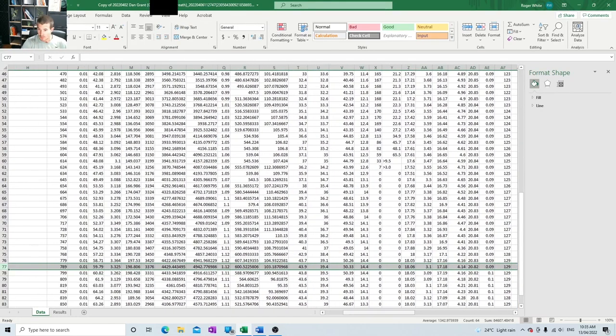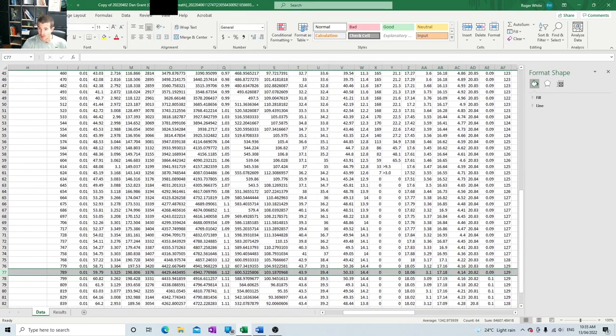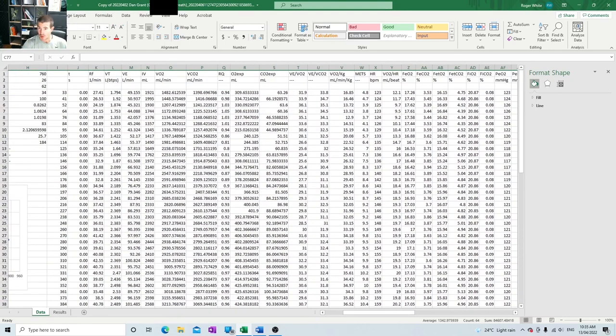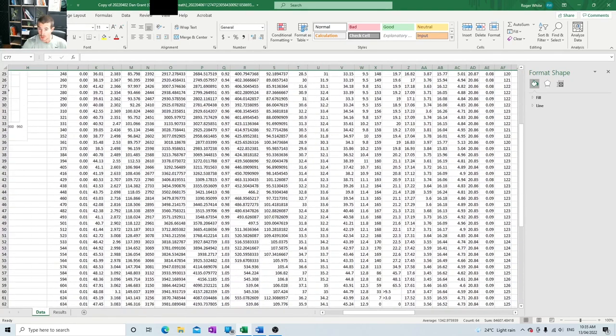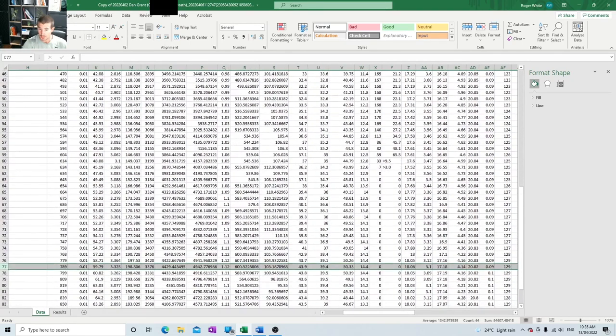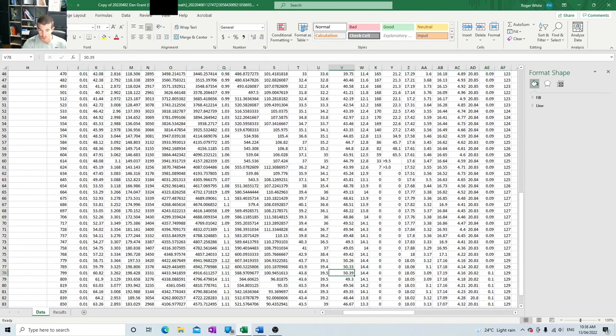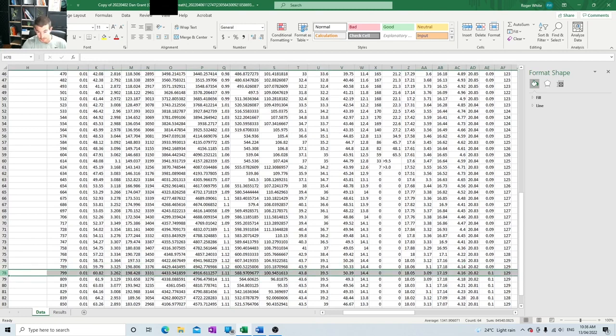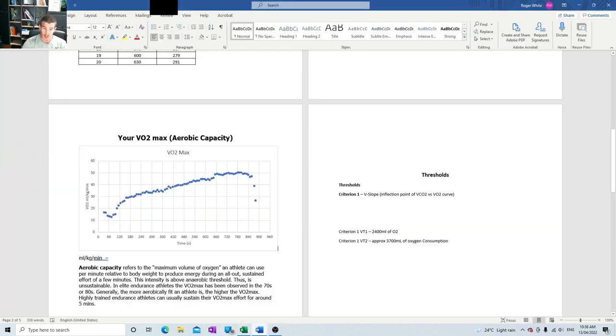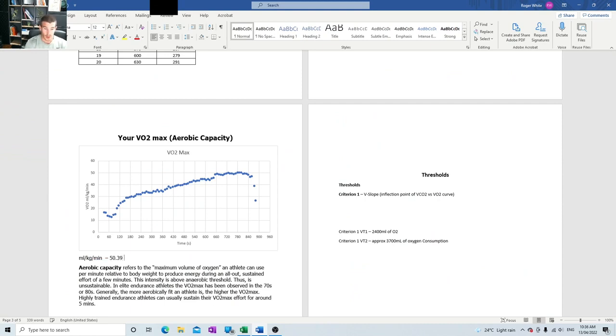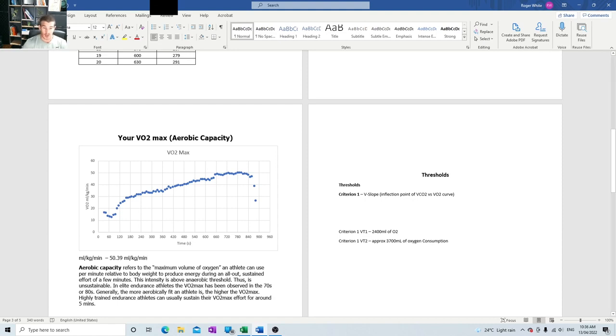We go over to VO2 max, which is this column here, follow that down. Now it was roughly around here. So we look for the biggest number there, which is 50.39. So 50.39 is this person's VO2 max. 50.39 milliliters per kg per minute. All right. So that's their VO2 max.